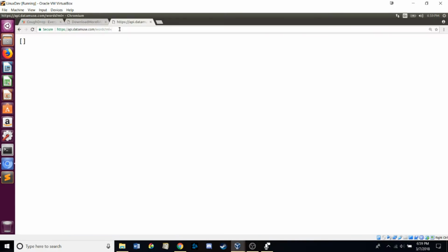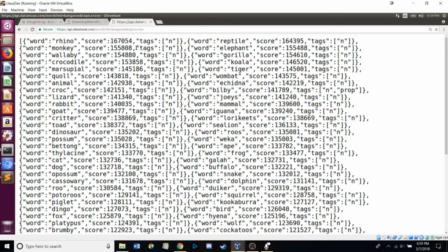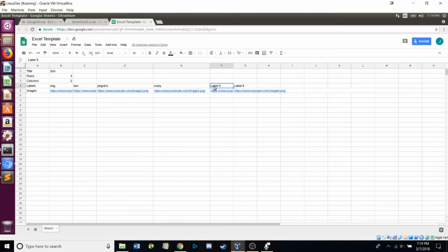We found the DataMuse API to generate word suggestions based on word association with existing words on the board. And we added a UI element to display suggested buttons in a sidebar and allow the user to add them to the board automatically. For the CSV portion, we created a template in Excel that users could fill in to generate new boards. After much prototyping, coding, and revision, we were ready to try our tools with real users.